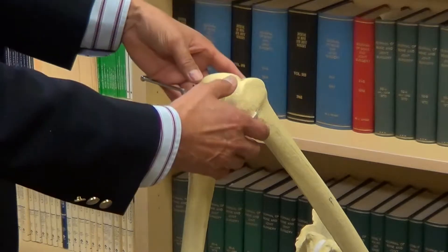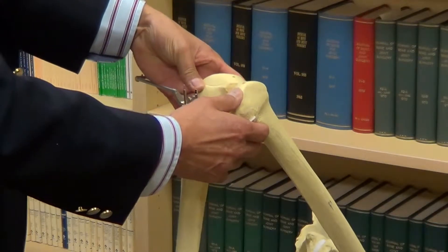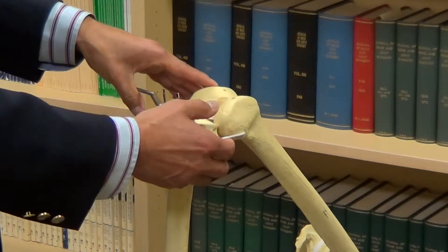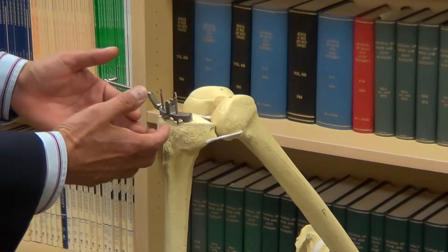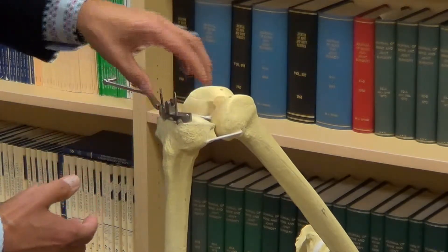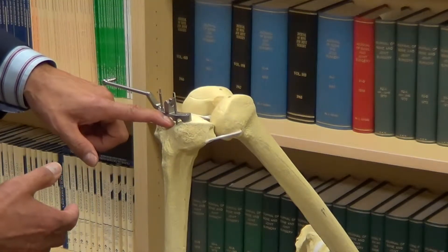On this model, we'll assume that I've already prepared the end of the femur. Once the femur is completed, with assistance from the surgical tech, we'll sublux or bring the tibia anterior, or forward. From here, with retractors, we attach this computer wing to the front part of the lower leg bone, the tibia.